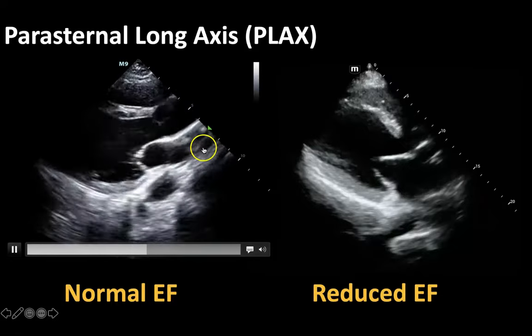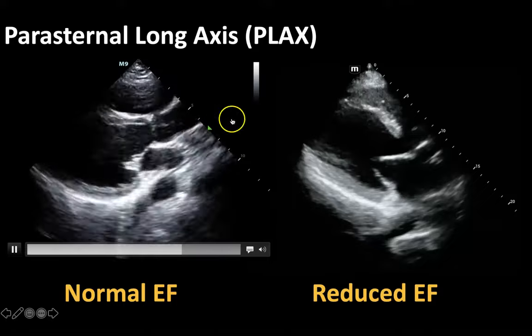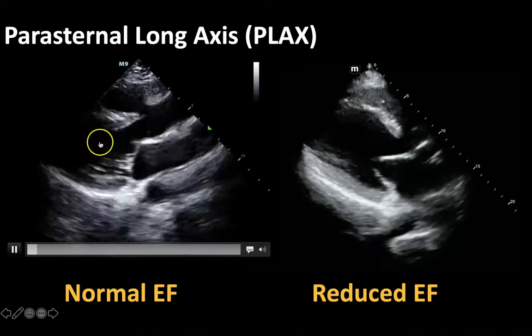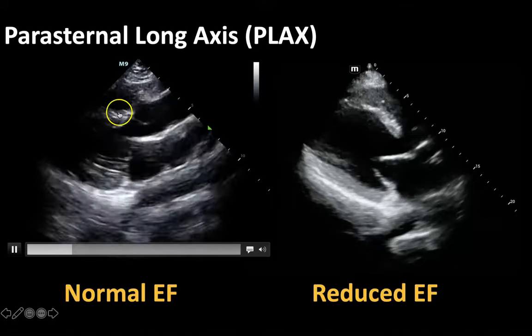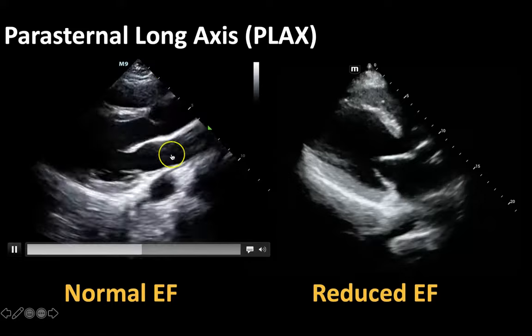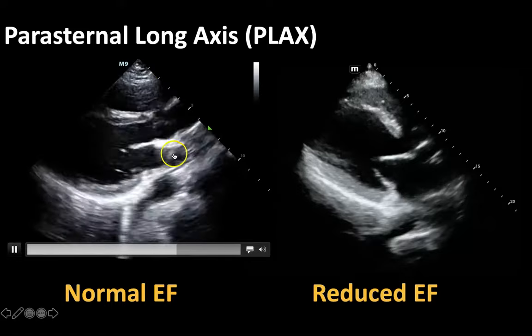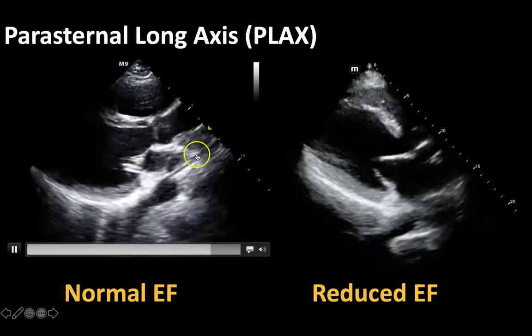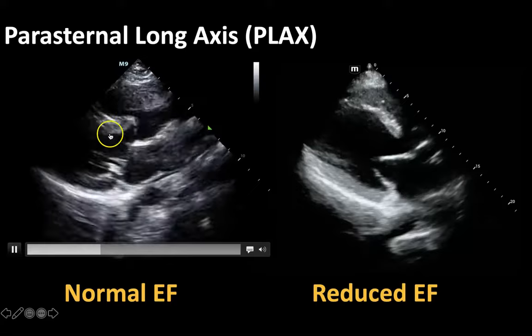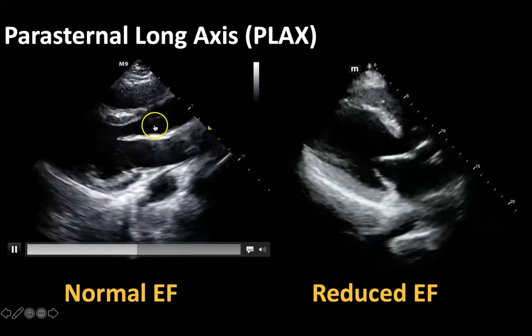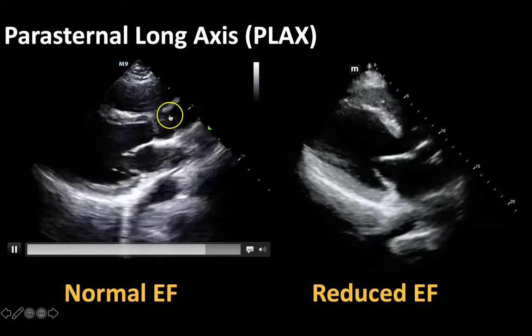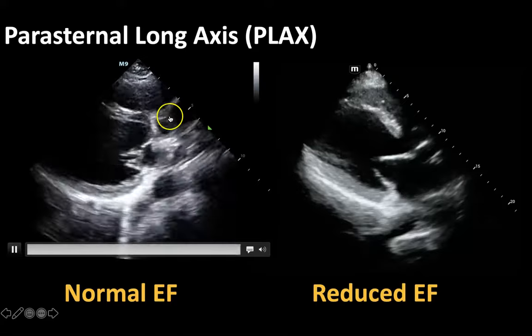So your basic anatomy. This is the long axis view of the heart, so you see most of the chambers. This is your left atrium here, this is your mitral valve, here's your left ventricle, your aortic valve, and your aortic outflow tract here.